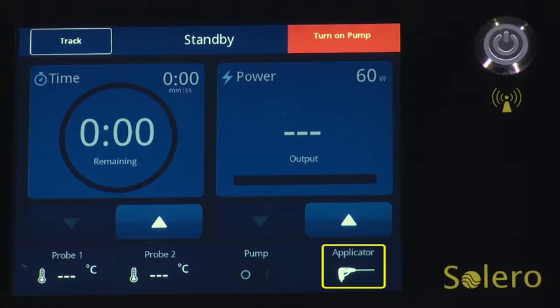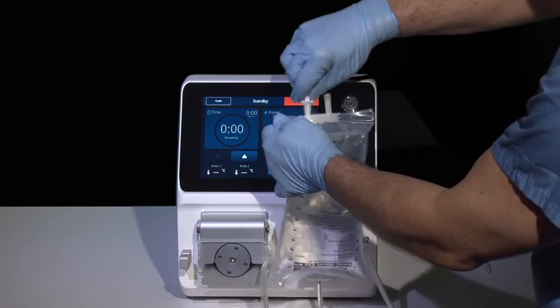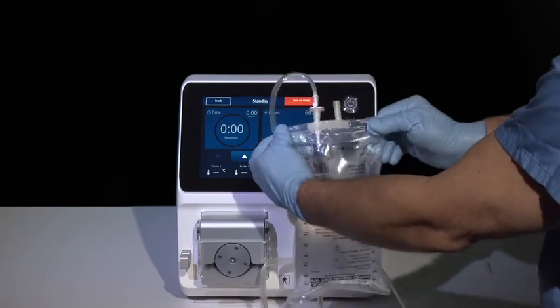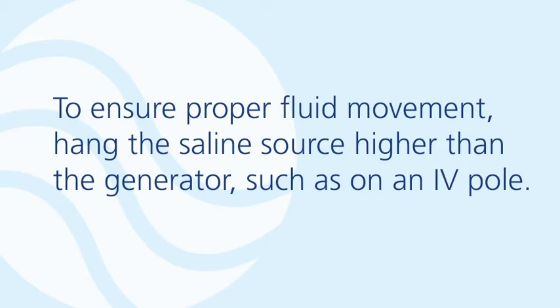The Solero system will remain in standby mode and prompt the user to turn on the pump. The pump should not be turned on until tubing has been attached. Remove the cap on the tubing set spike and insert the spike into a minimum of 1,000 milliliter saline source. To ensure proper fluid movement, hang the saline source higher than the generator, such as on an IV pole.